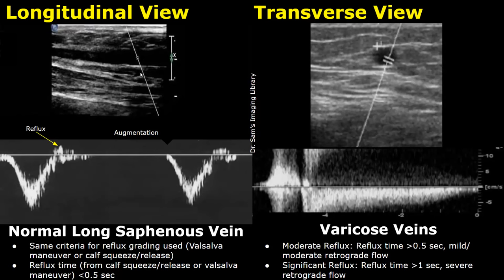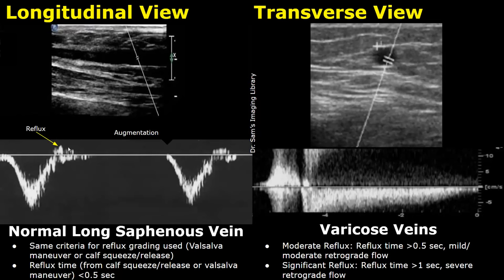In this image we can see a normal spectral waveform of the long saphenous vein. When the calf squeeze is released, there is a small amount of retrograde flow. This small amount of backward flow is normal, and this duration of backward flow can be calculated on the spectral waveform. In normal cases it should be less than 0.5 seconds — if it is less than 0.5 seconds, this is normal.